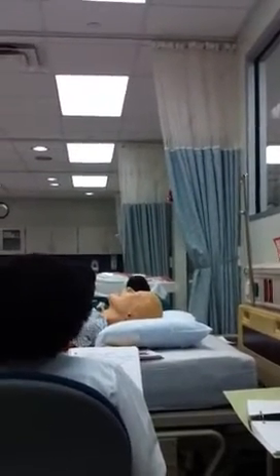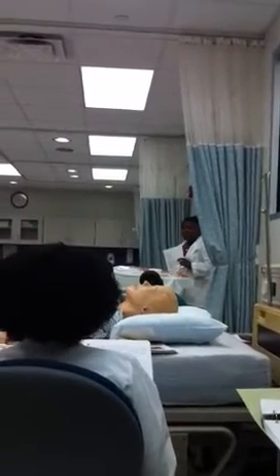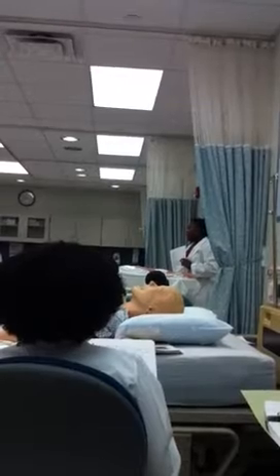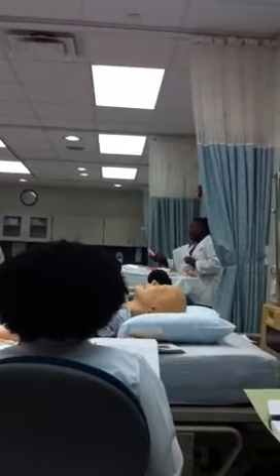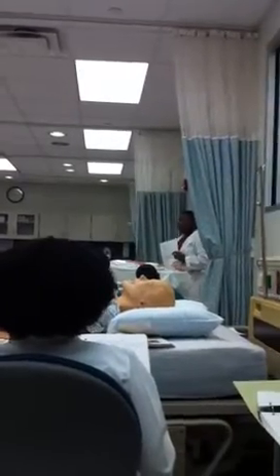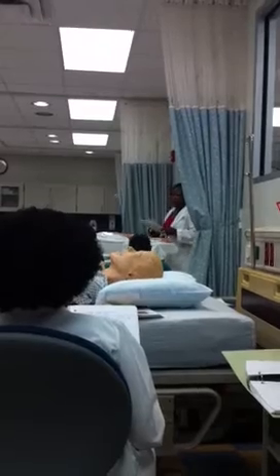Good morning, Miss Smith. How are you doing today? My name is Toyin. I have your insulin for you this morning. I did your blood sugar already and it's 300 and something. It's 352. So we're going to give you your Humulin N now. But give me a second to go and wash my hands.